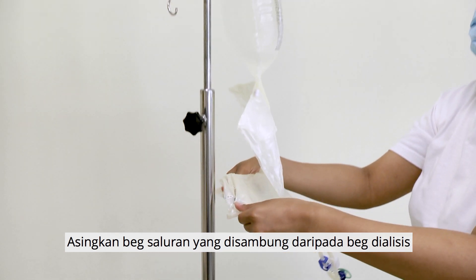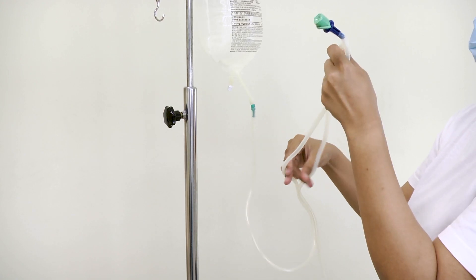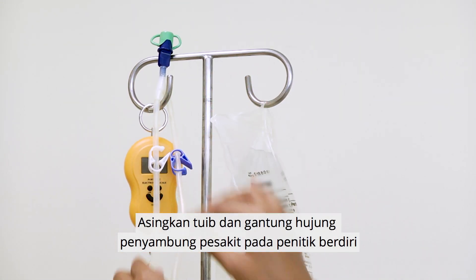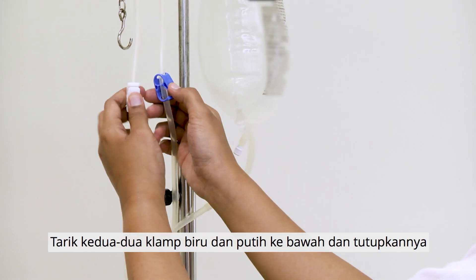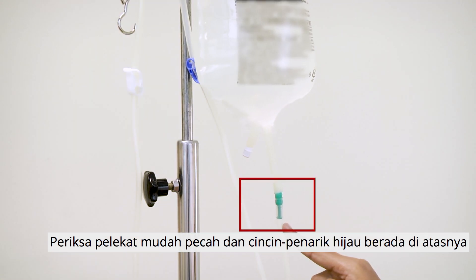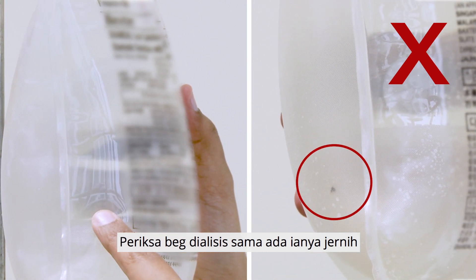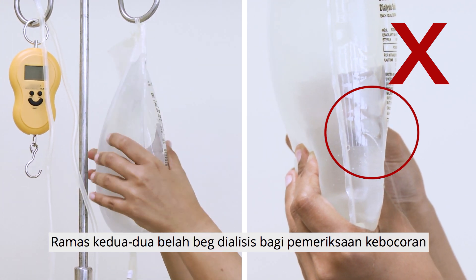Separate the attached drain bag from the dialysis solution. Separate the lines and hang the patient connector end on the drip stand. Pull both the blue and white clamps down and close them. Check that the green pull ring and frangible seal are intact. Check that the dialysis solution is clear, and squeeze both sides to check for leaks.